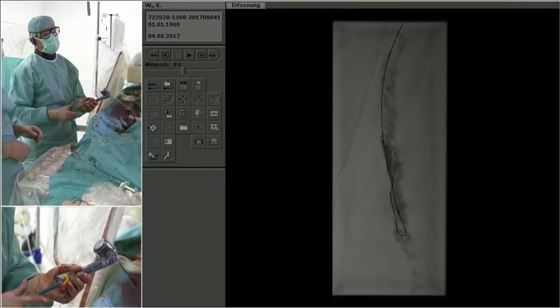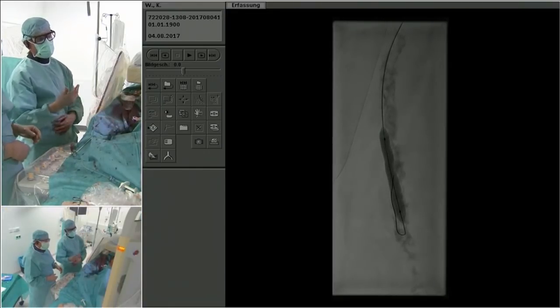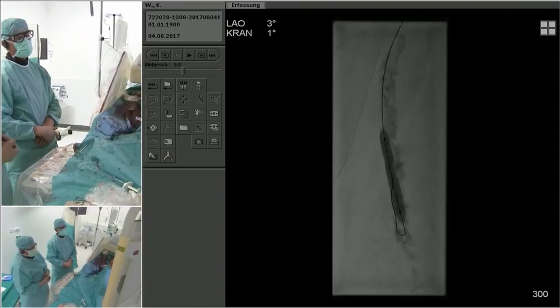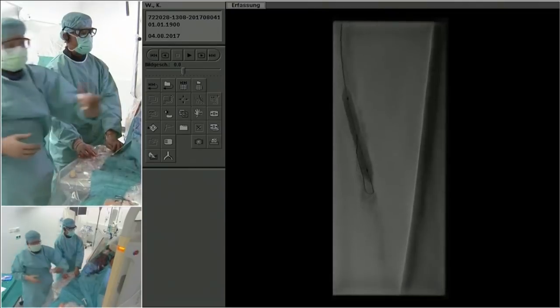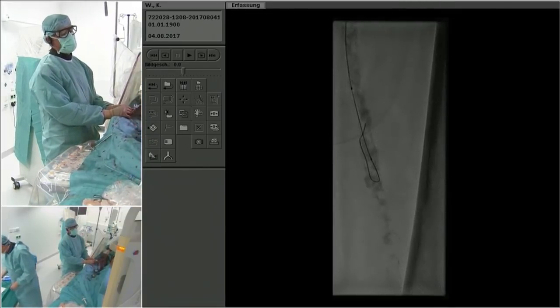Yeah, you mean hemodynamically significant? Probably not, no. I would probably first treat, or let surgery be done on, the common femoral artery before I treat this artery here. There is a little bit of a profunda stenosis. However, I'm not sure whether this is really significant and will help him sufficiently in the end. But clearly, if there had been more, we would have done differently.